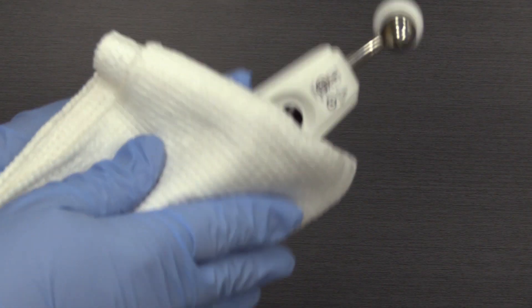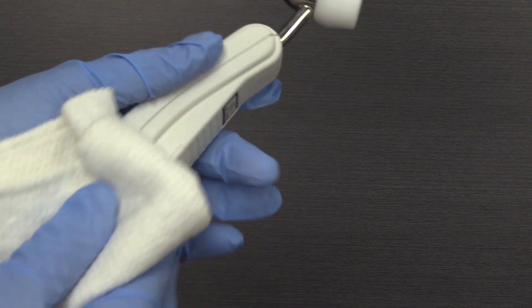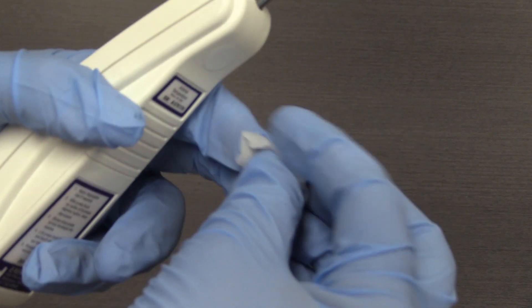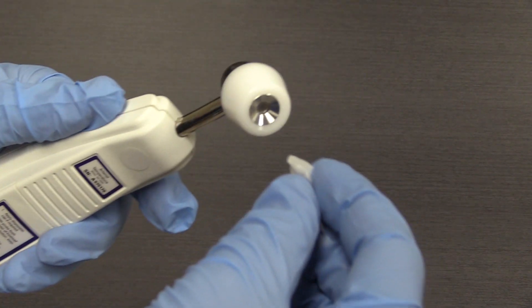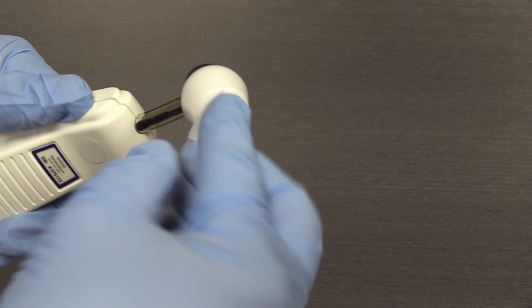To clean the thermometer if needed, simply wipe it down with a clean cloth that has been sprayed with a DFR-approved disinfectant. The probe should be wiped down with an alcohol wipe after each use, paying special attention to the sensor itself to ensure that it is clean and free of residue.